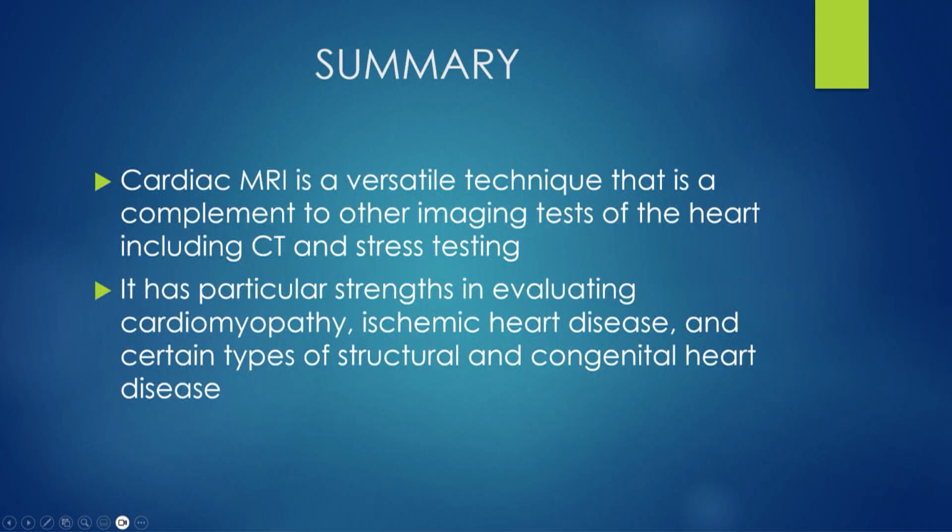It's just a tremendously valuable technique. It's a great complement to cardiac CT, has particular strengths in cardiomyopathies and ischemic imaging. And so this is another growth area for us along with cardiac CT. So I really want to, even though I know it's not something that as many people are doing, it's something I really want to give a plug to.